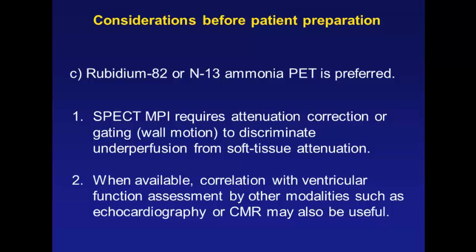Now, there is the problem that if you're not using attenuation correction, you not just mix two technologies with different spatial resolutions, you also mix corrected images with uncorrected, and you might have then an attenuation artifact, which is then, of course, taking up FDG, and you think, oh, this is hibernating myocardium. Again, if there is an attenuation artifact, maybe it's not contracting there either, because the contour detection is difficult. Watch out for this and use attenuation correction if you take SPECT.